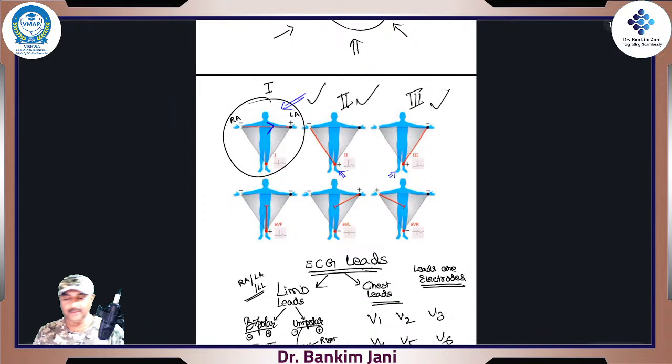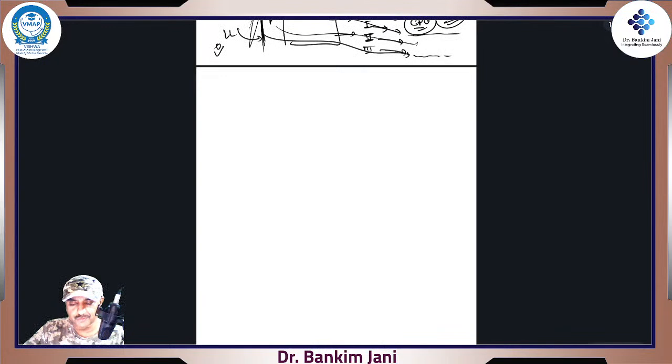And at this point of time, don't worry much about what would happen to P wave and Q wave. QRS will come. You'll see that thing by yourself. Now we move on to the very important part, and these are the right vector, left vector, and the foot vector. Right? Things are crystal clear. In this, no strain. This is the heart. This is the heart, right? This is the heart. Chalo.